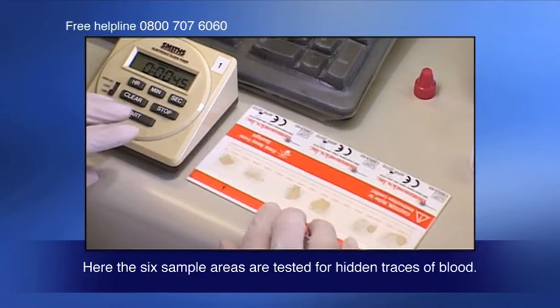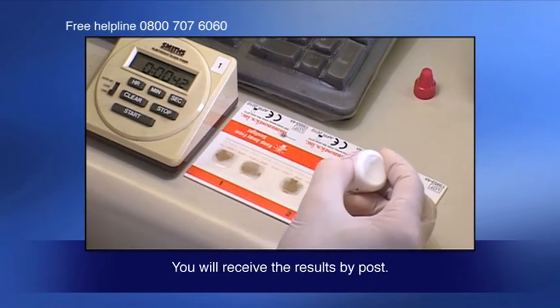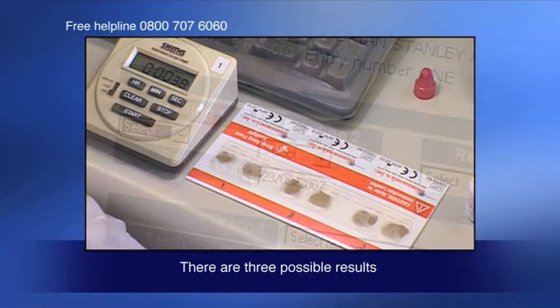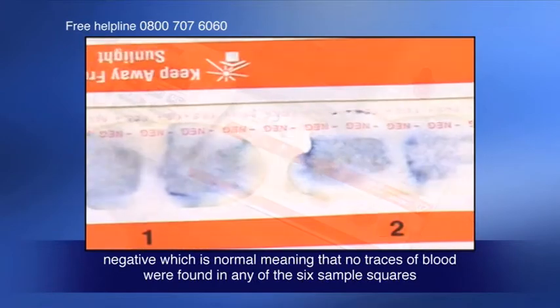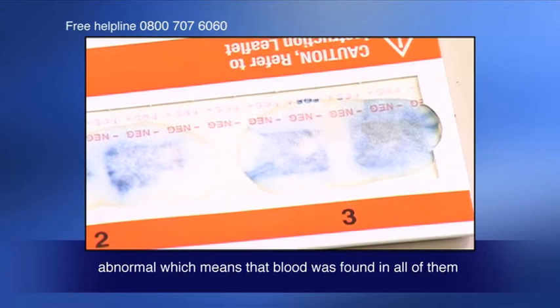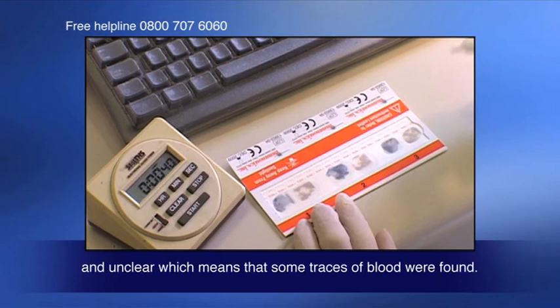Here the six sample areas are tested for hidden traces of blood. You'll receive the results by post. There are three possible results: negative, which is normal, meaning that no traces of blood were found in any of the six sample squares; abnormal, which means that blood was found in all of them; and unclear, which means that some traces of blood were found.